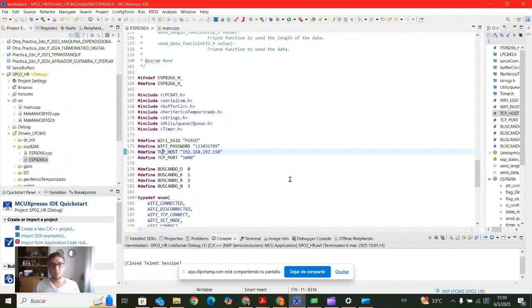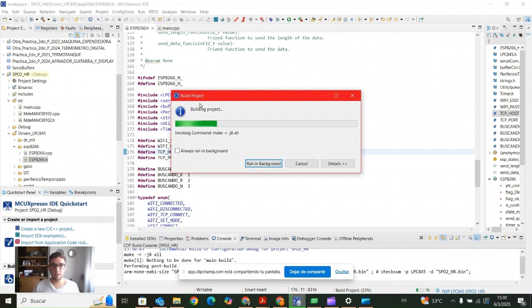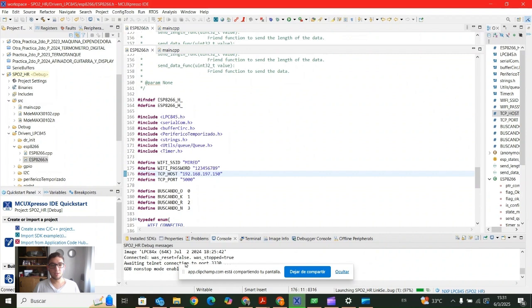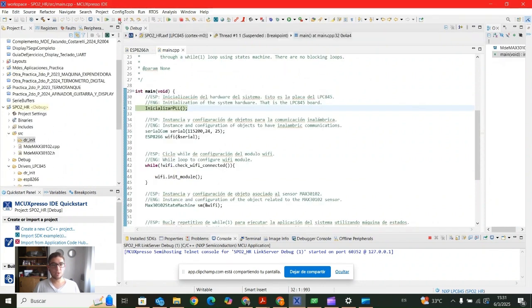Okay. Then, with this, we are going to compile. Let's wait for the project to be compiled. And at this moment, I have only the microcontroller connected to the computer, the LPC845. After the compilation, we're going to load the program, actually upload the program into the microcontroller. We're going to click on this symbol, and after the uploading, we are going to click on terminate.